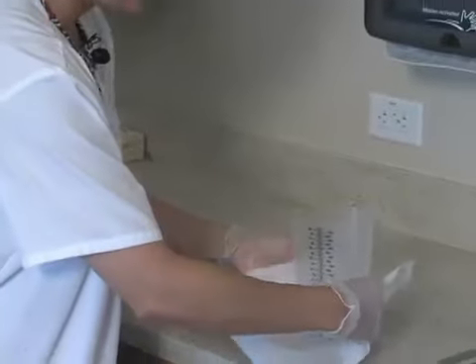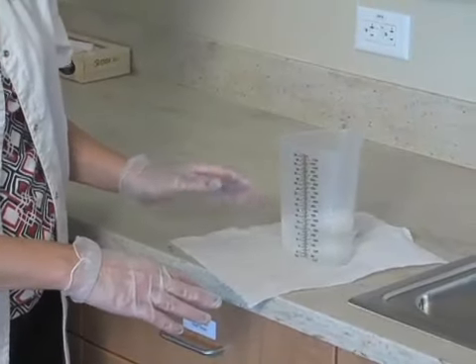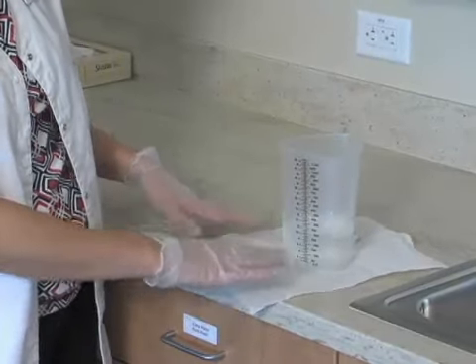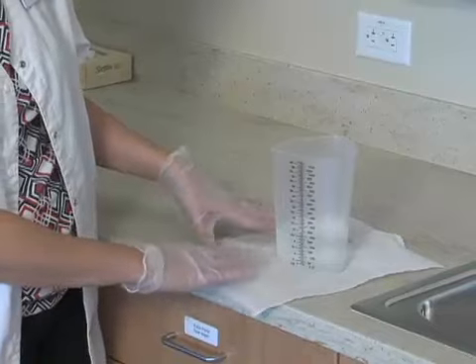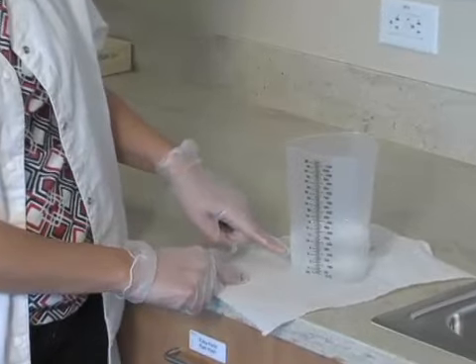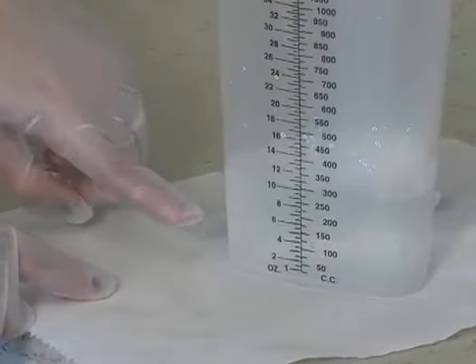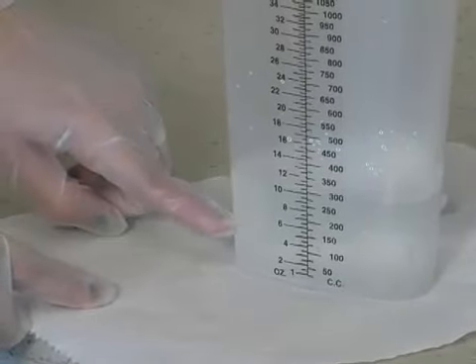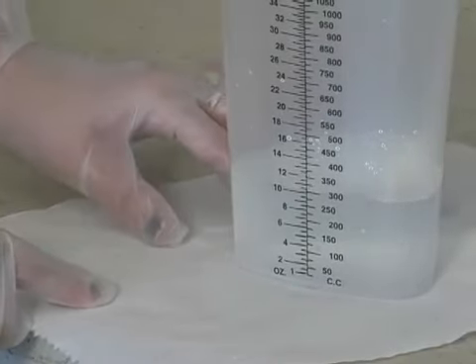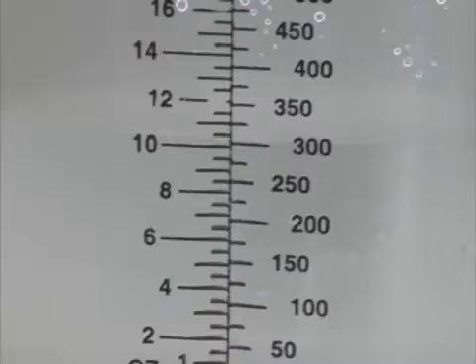Place the graduate with the urine contents on a flat surface. You want to make sure that you never place any bodily wastes on an overbed surface. It has to be on a dirty surface, and it has to be flat. Before you record any urinary output, you want to make sure that you check the urine for the color, odors, and any sediments and clarity, and make sure that there isn't anything abnormal that you need to report to the nurses. Now, in order to read accurately, I need to read at eye level.